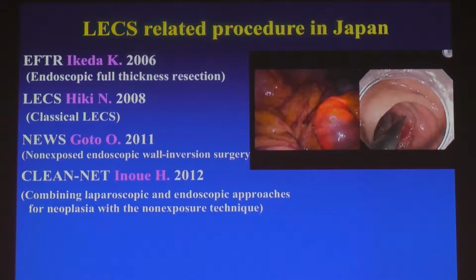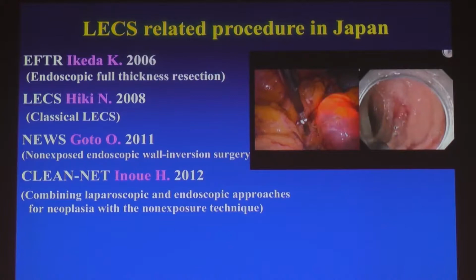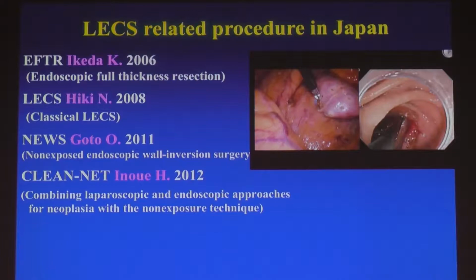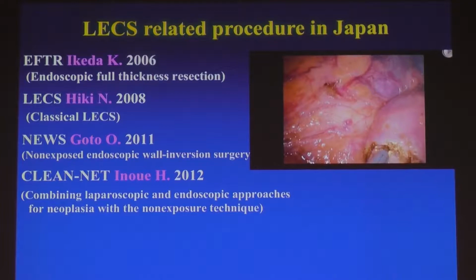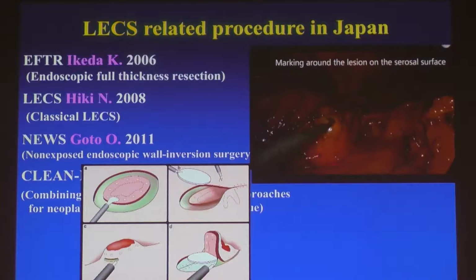Since ESD was developed in Japan, new procedures such as LECS, meaning laparoscopy and endoscopy cooperative surgery, and also NEWS, meaning non-exposed endoscopic wall-inversion surgery, and CLEAN-NET, developed by Professor Inoue. Especially in Japan now, LECS has been becoming more and more popular for gastric tumor. This method was approved for reimbursement by the Japanese government.